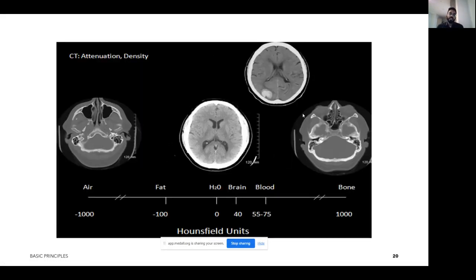Again, coming to CT head, if you look at this one in the middle, this is a normal CT head view where they are focusing on the parenchyma, the soft tissues. All the soft tissues are well seen, but the bone is not very clear. But if you put a bone window, you can see the bones all clear, but the parenchyma is quite obscured. This helps us to pick up if there is any fracture in those skull bones or facial bones. Now, this is called a blood window.